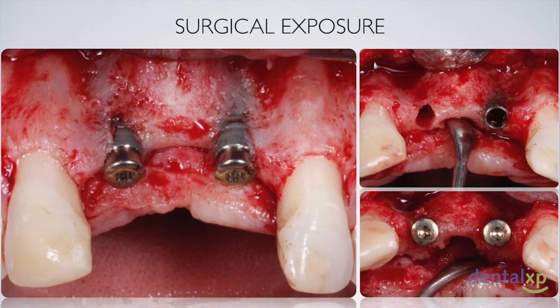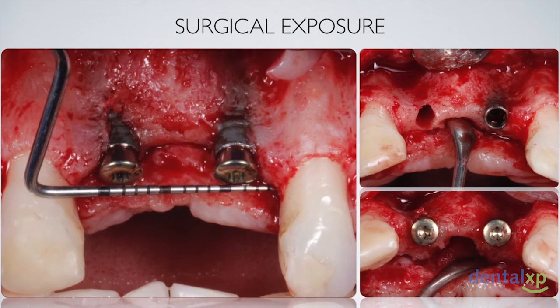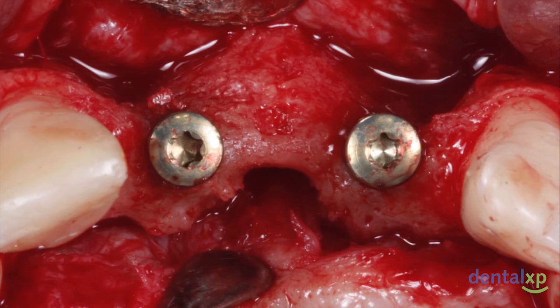And in addition, we used a 2 mm healing abutment on these implants to tent our membrane to the level of the interproximal peaks of bone on the adjacent laterals. So that part was performed, and then in order to graft vertically around this area, sometimes we are faced with the challenge of the nasopalatine bundle and or canal in this site. And in such a case, it is in our way if we're trying to attempt any augmentation procedure in the area. So what options do we have to overcome this problem?